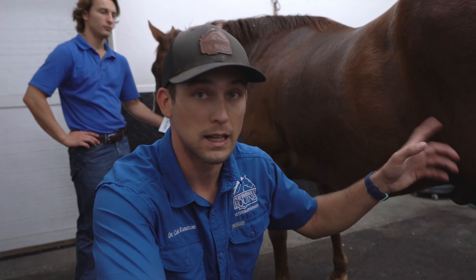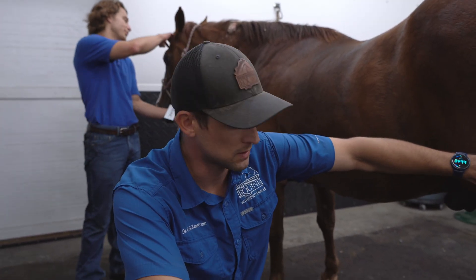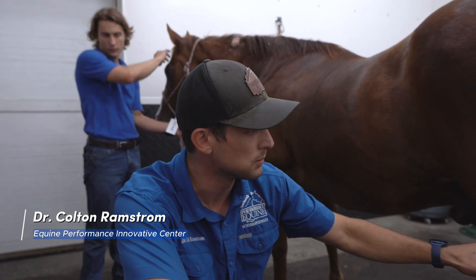So far we've done our dynamic evaluation on him. He's got a pretty significant left hind lameness, positive both the lower limb and upper limb flexion.